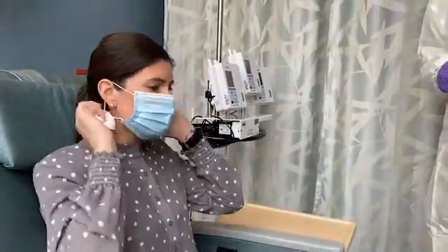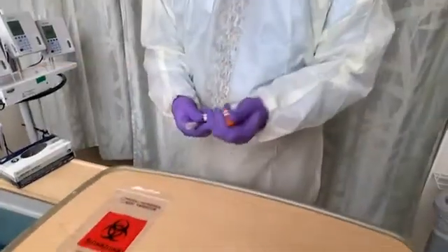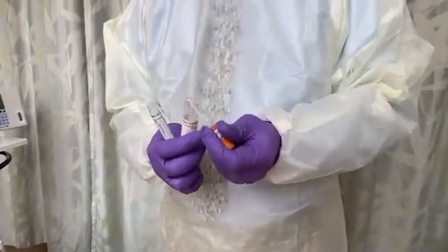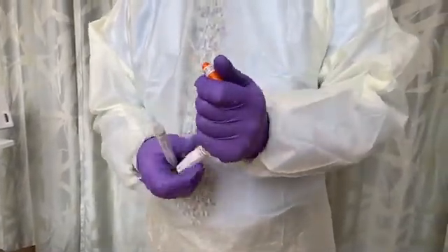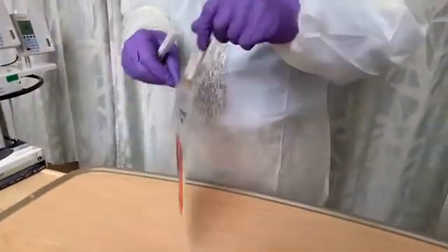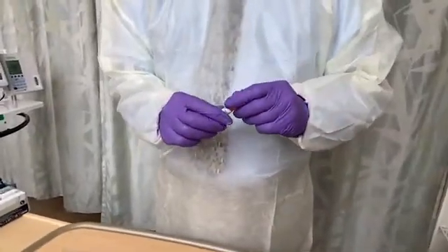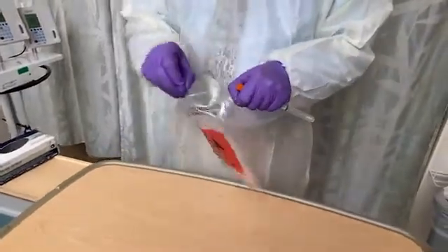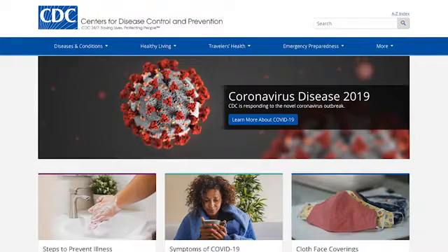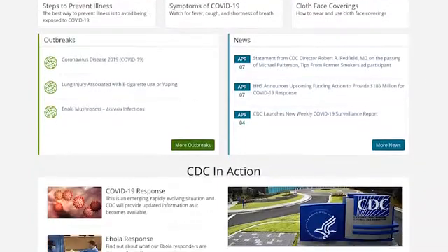Ask the patient to reapply her mask. Open the collection tube and insert the swab into the tube. Break the swab at the groove. Discard what remains of the swab, close the labeled collection tube, and place it in a biohazard bag. The sample may also be returned to its original packaging for transport, depending on institutional practices. Follow the CDC directions for direct processing of the swab specimen or placement of the swab in media, with or without refrigeration.